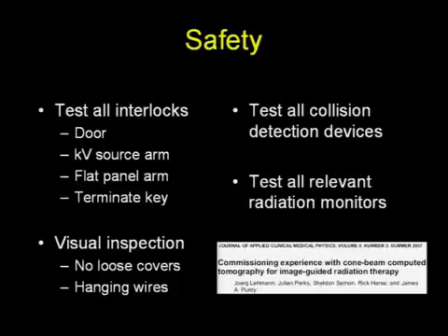Users are also well advised to do a visual inspection of the device before starting today. Make sure that if there was a service intervention the night before, there are no wires or covers hanging out. And again, test all relevant radiation monitors.